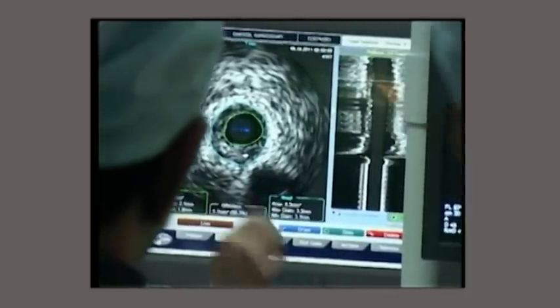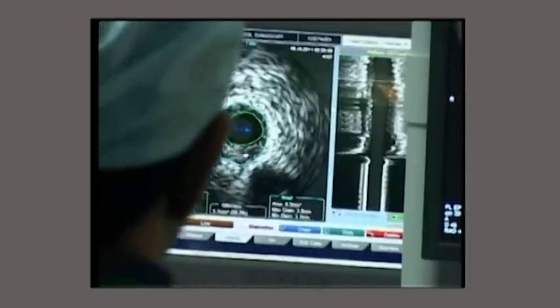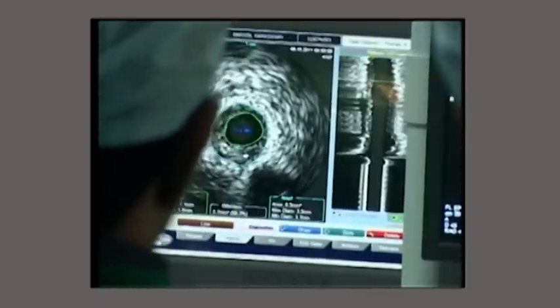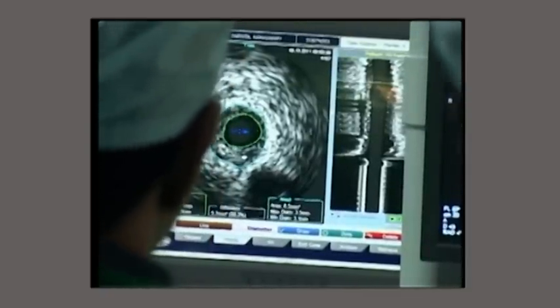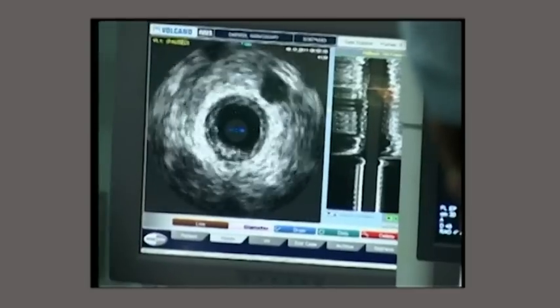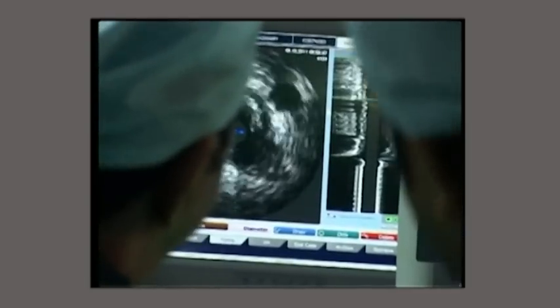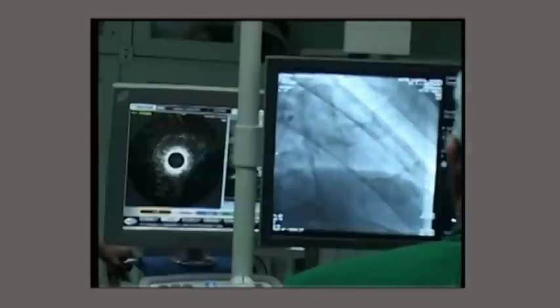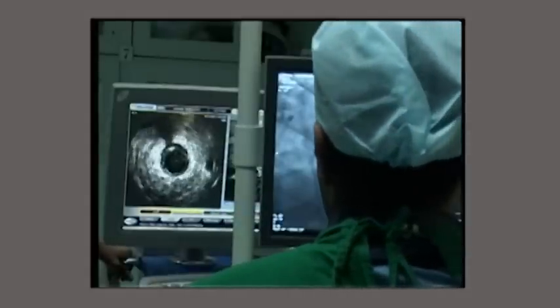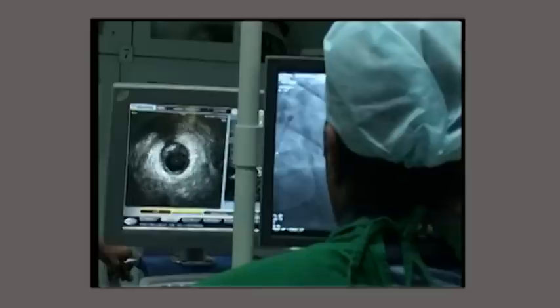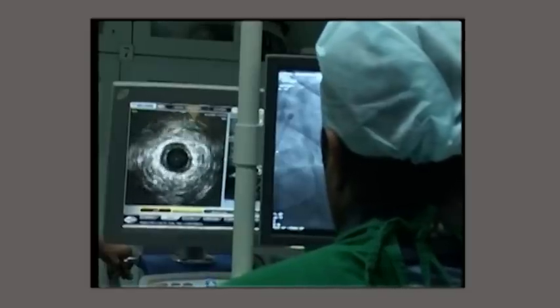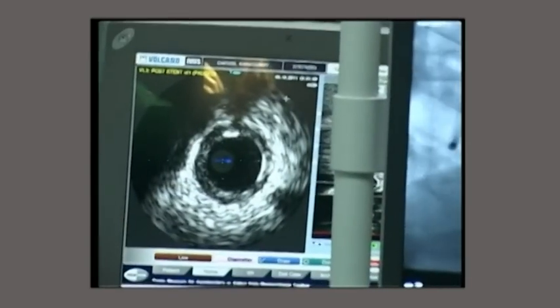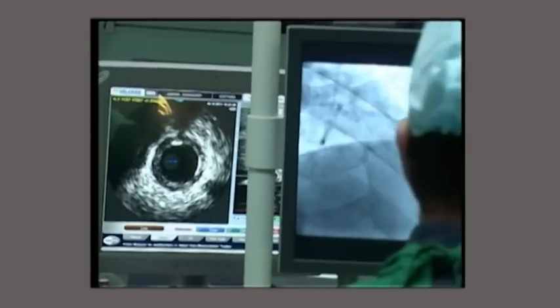Looking at the lumen of the coronary, the plaque burden appears to be causing close to 70 to 80 percent stenosis in the proximal segment of the LAD artery. This is a Xience Prime stent which I deployed at 14 atmospheres. I then performed a post-stent IVUS examination to look at the struts of the stent and confirm they are well opposed on the arterial wall, and took a pullback.